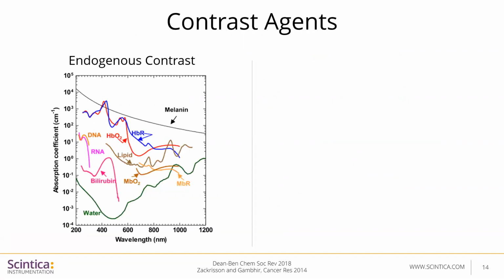Various imaging agents can greatly enhance the photoacoustic imaging contrast. There are typically two types of contrast agents. One is the endogenous contrast and the other one is an exogenous contrast.